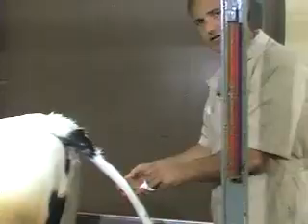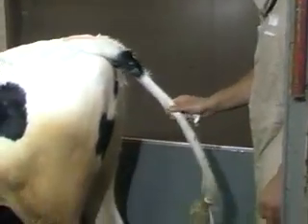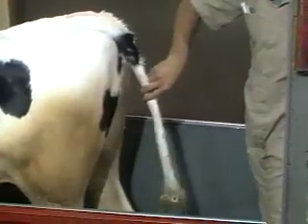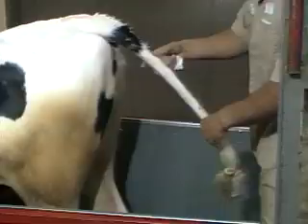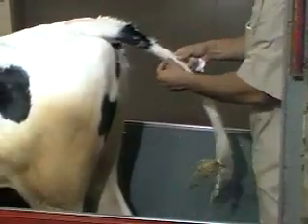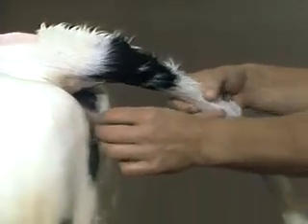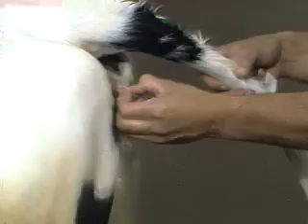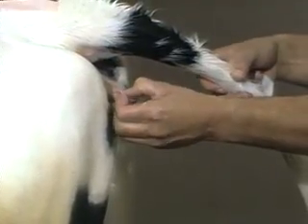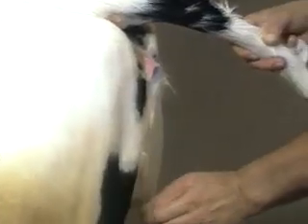The test for successful epidural anesthesia is to grasp the tail, shake it back and forth, and check for laxity. This cow has no control of her tail — she's just totally limp. Not only that, she has no sensation of pain upon pinching, and even if you get to a sensitive area like the vulva, pinching of the vulva as hard as you want raises no sensation. And then you can test the loss of sensation all the way down her rear parts as well.